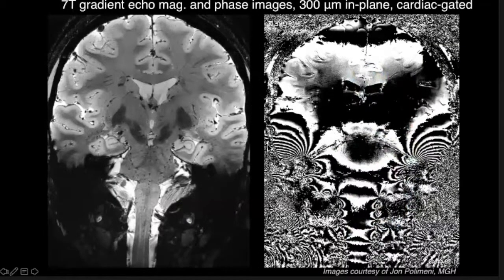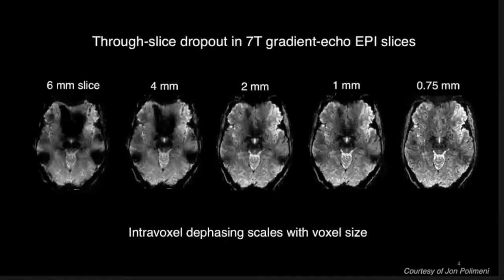And this gets worse at ultra-high field. This is just a nice image from John Polamani showing how bad the phase gets in a gradient echo image due to this B0 variation across the brain introduced by the air tissue interfaces. This also causes problems like dropout. If you have a thick slice, you get this very characteristic black spot from through-slice phasing. It gets better with thinner slices, but you can't always acquire with a 0.75 millimeter slice.